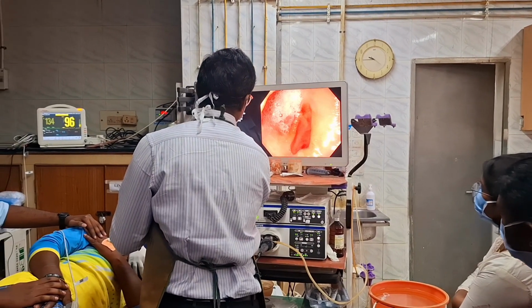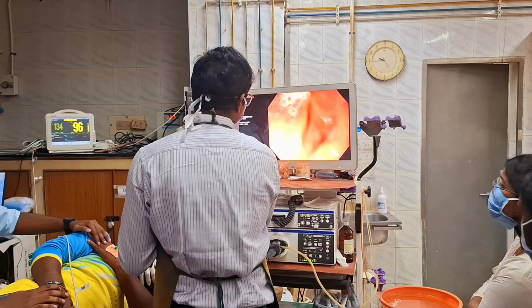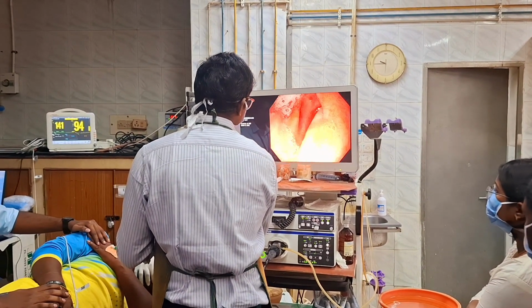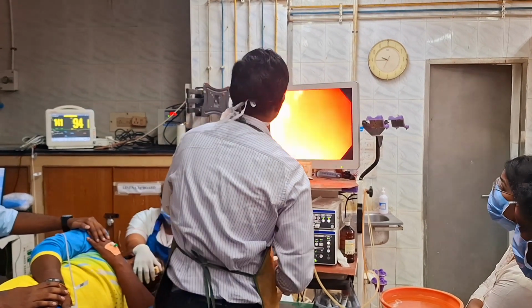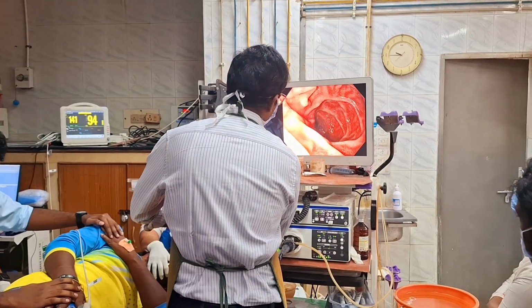After the pylorus we are reaching D1. So this is D1. D1 will be a smooth surface with the lateral. This is bulbar duodenitis or... Now we are at D2.